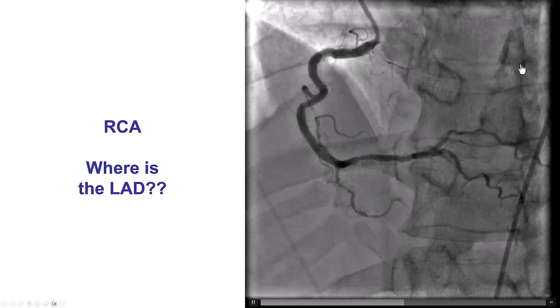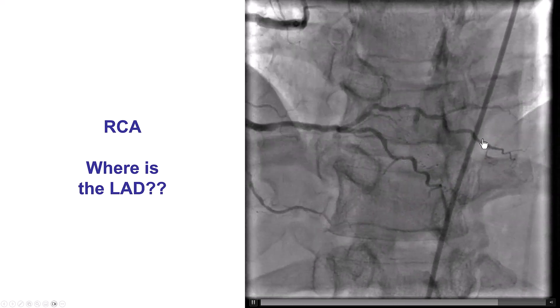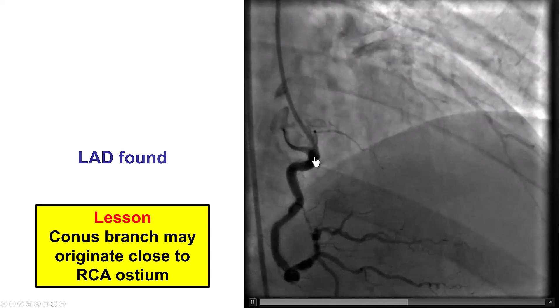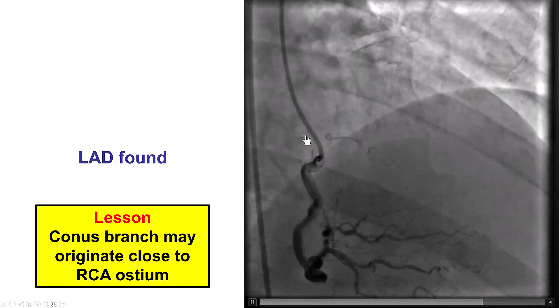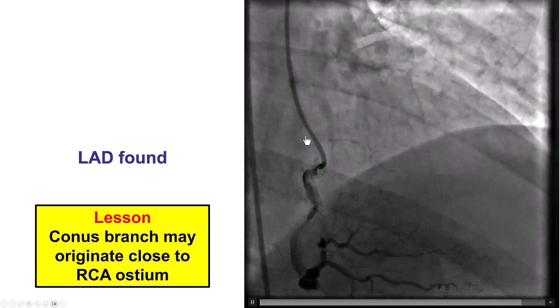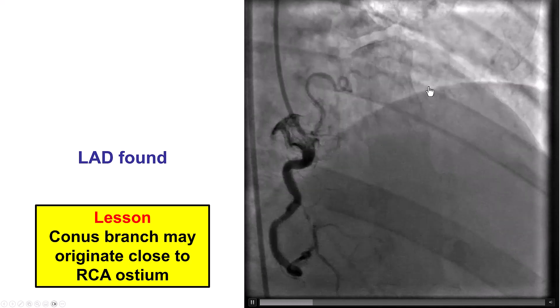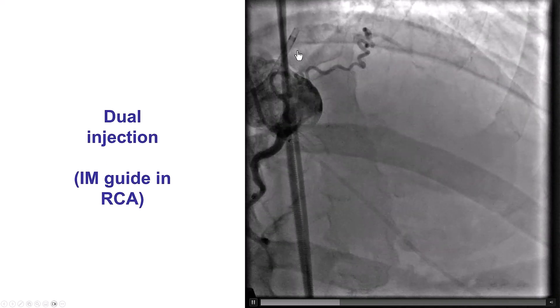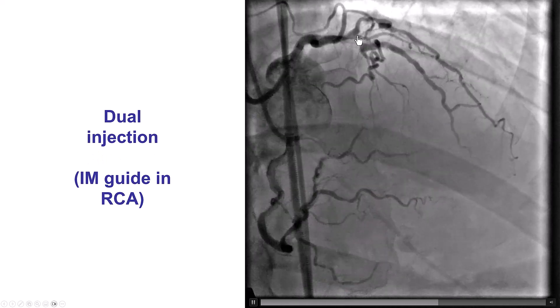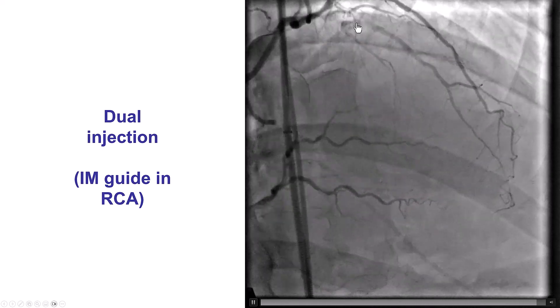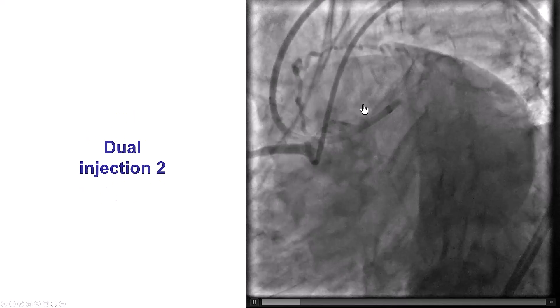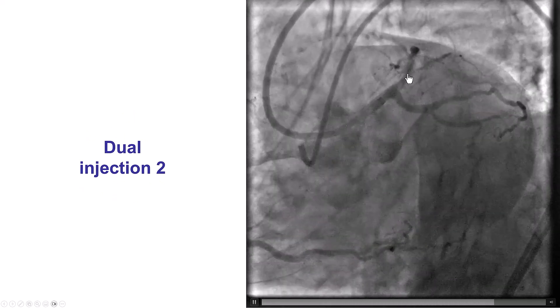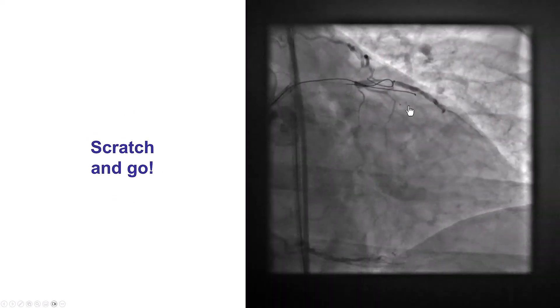This is the right coronary artery. We don't really see much filling of the LAD. However, once we take a picture with the catheter less deeply engaged, we see a Vieussens' collateral that comes from the proximal RCA and actually fills the LAD. Doing a dual injection, it becomes much more clear that the CTO is actually a fairly short CTO, and doing orthogonal projections helps further clarify the location of the proximal cap.